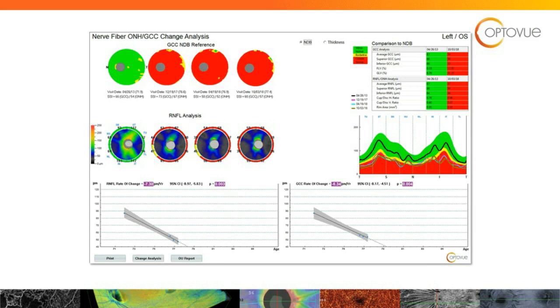I don't typically do that. I just have a list of dates always in my EHR. So as I'm looking at the progression analysis, I can tell at a glance where we did a change in therapy, and then I can see, okay, are we achieving the stability results that I want? That's an excellent question. All right, so now the next question, we'll try to hit one or two more of these, and then we'll wrap it up.